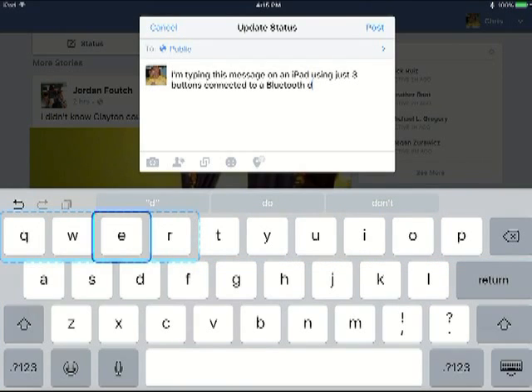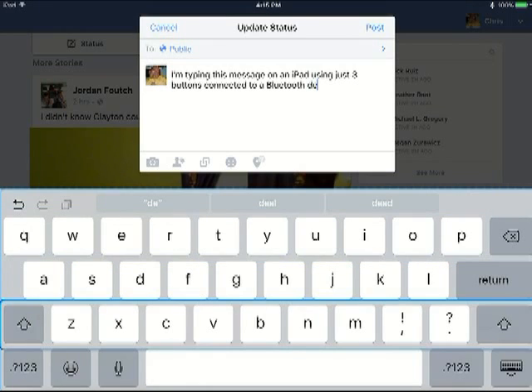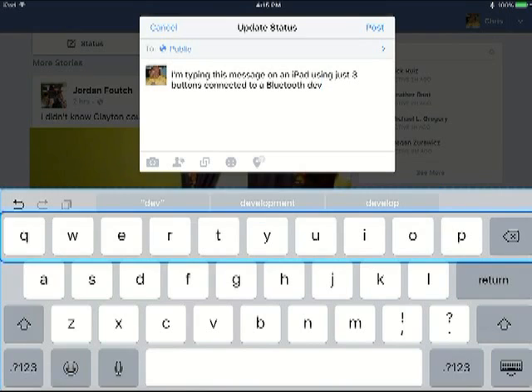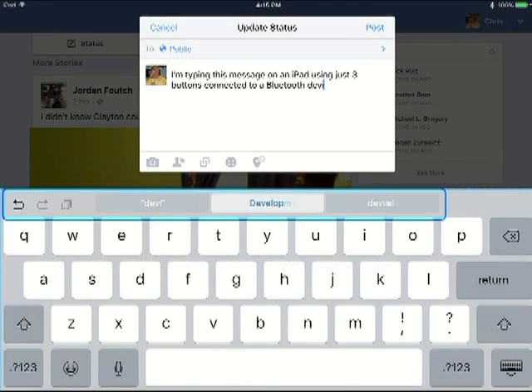iOS 9 has a lot of different accessibility features. In addition to the row and column scanning, there are ways to scan the screen without actually selecting items. It's sort of like a crosshairs. It scans back and forth, up and down, and it will let you click anywhere you want, even if it's not a menu item or a button.